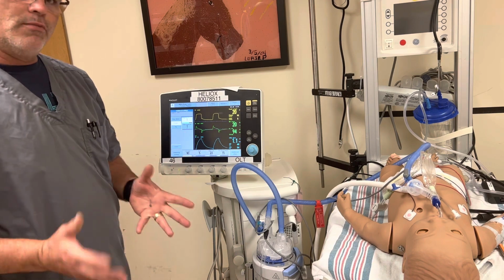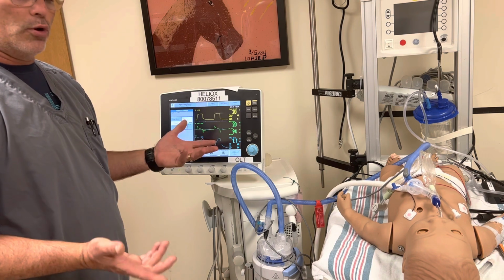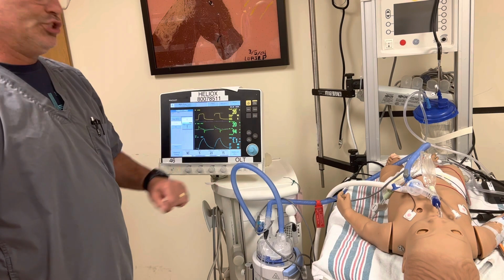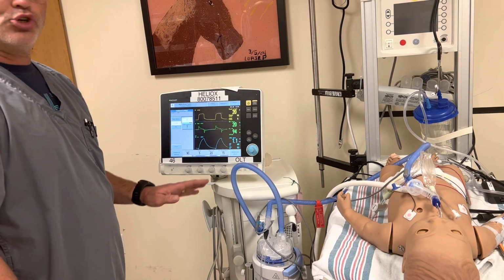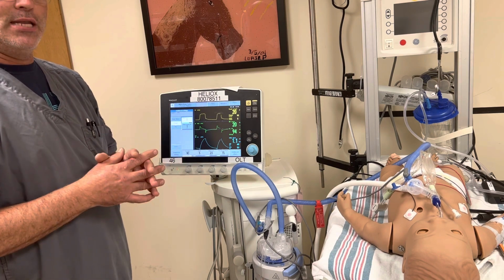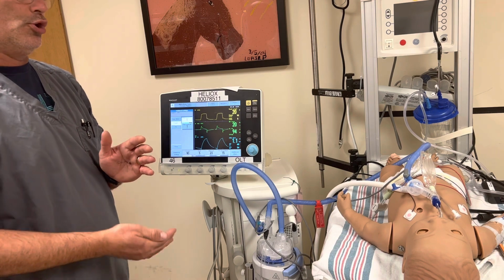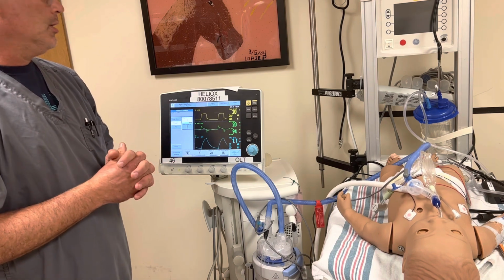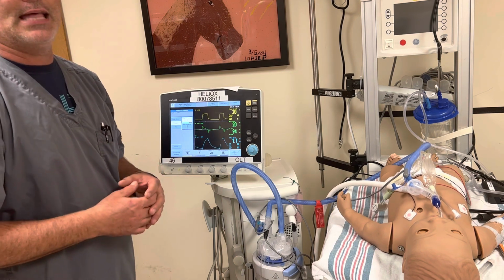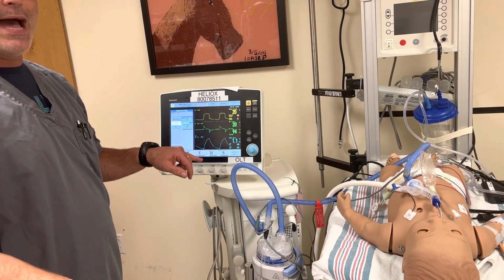And that could occur from multiple things. The most common here is if you have an uncuffed tube or a leak, some of the flow won't return to the expiratory cassette, and that's where the servo is looking at if the flow is missing and thus giving another breath, right? It'll escape out the leak into the room and it won't return. The bias flow won't return to the expiratory cassette in the percentage it needs to be, and the vent will think this patient is taking that flow and then give them a breath. So what we want to do is make it as sensitive as possible without that occurring.